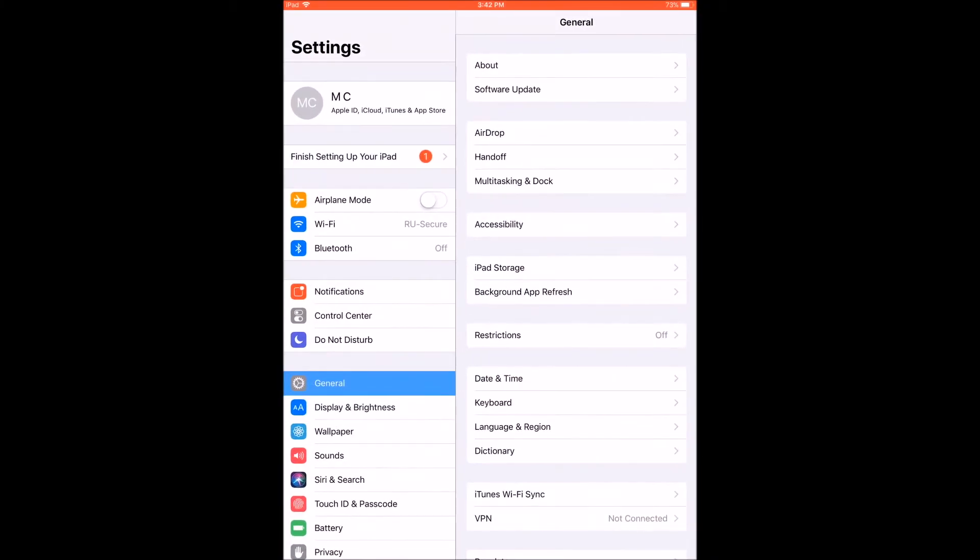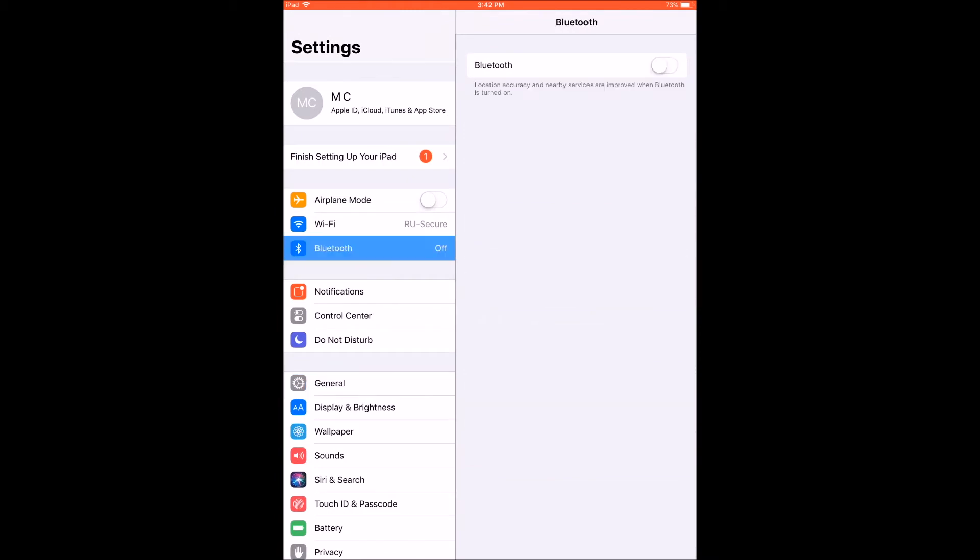On your iOS device, go to Settings, Bluetooth, and turn Bluetooth on.